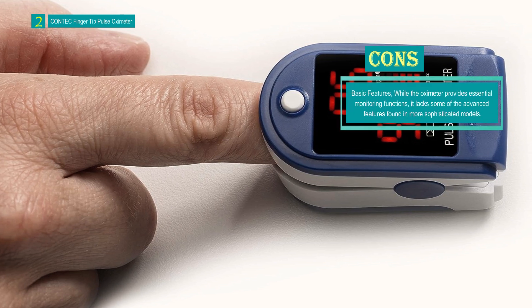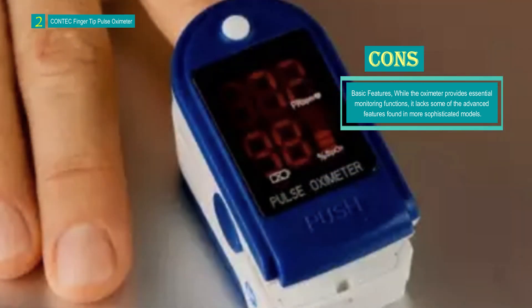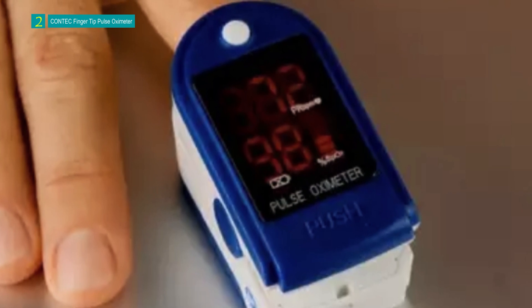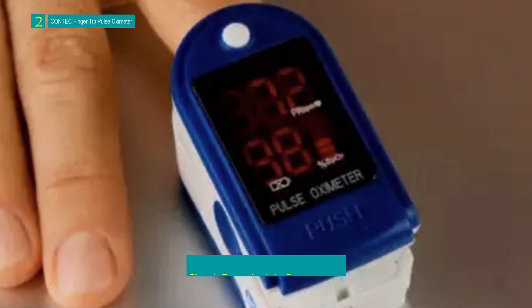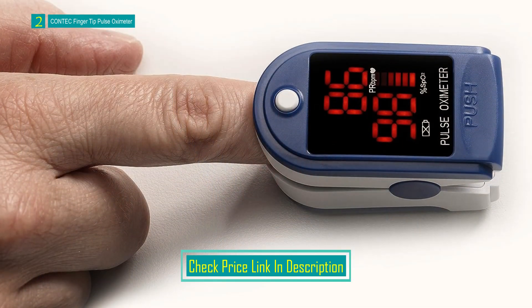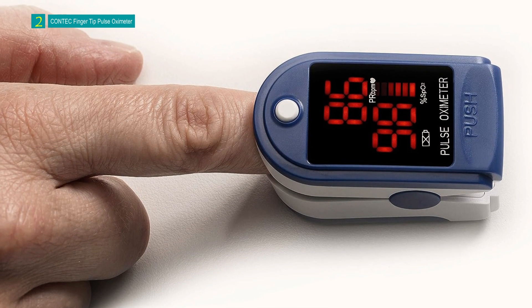The package includes the fingertip pulse oximeter, a lanyard, wrist cord, and an instruction manual. The CONTEC Fingertip Pulse Oximeter is a handy and practical device for individuals seeking a simple and portable solution to monitor their blood oxygen saturation levels and pulse rate. Its quick readings, long battery life, and LED display make it a reliable tool for on-the-go use.